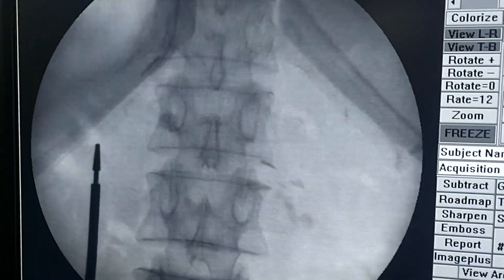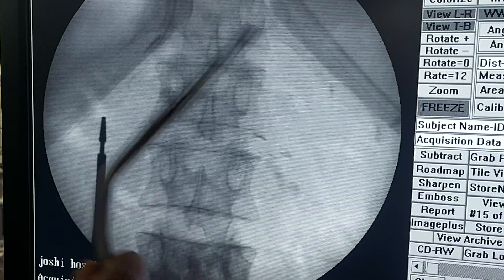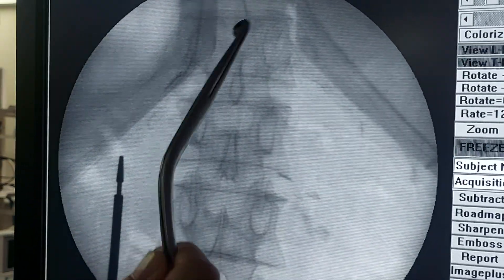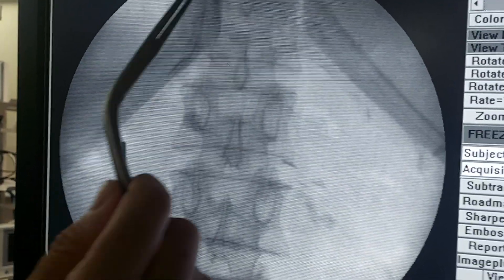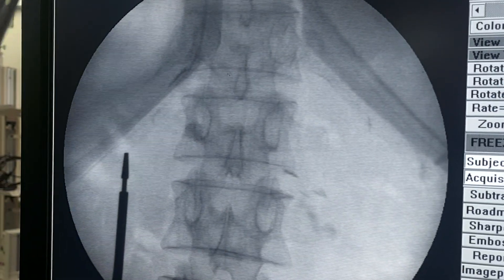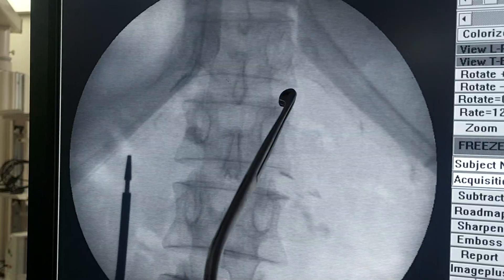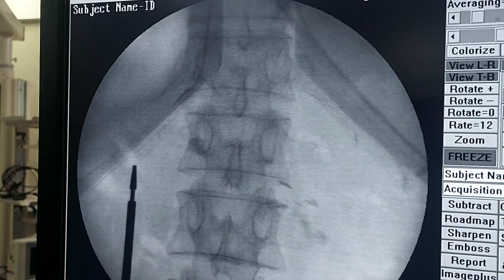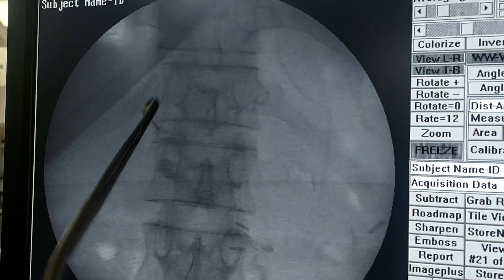We take a fluoroscopic shoot and select T12. You can see the 12th rib, the vertebral body, the spinous process, the pedicle, the rib, and the intervertebral disc. We ensure the image is perfectly squared in a true AP view so the vertebral body is well visualized.